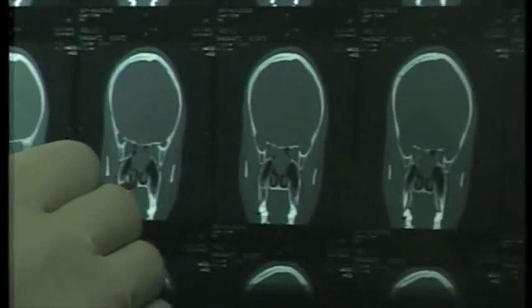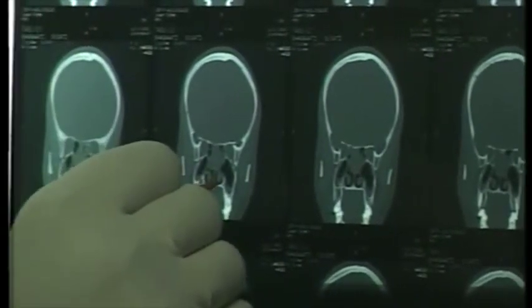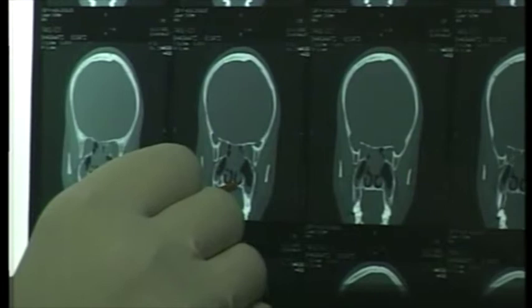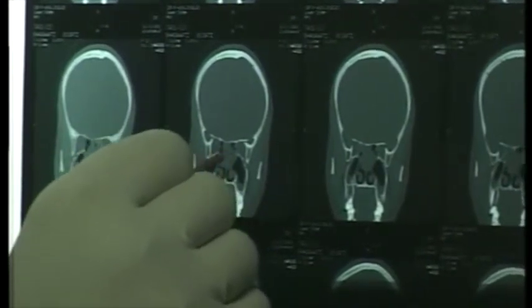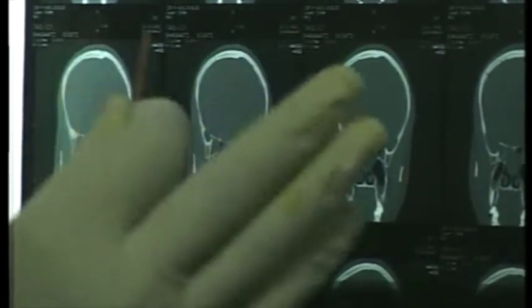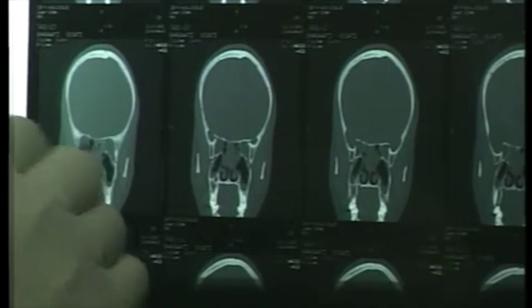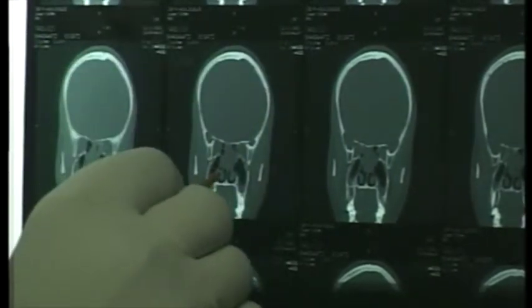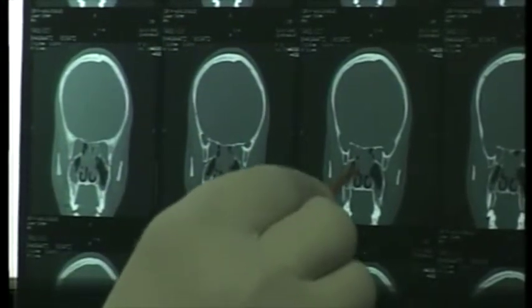The inferior turbinate attaching to the medial wall of the maxilla is very low. You must be having a very wide sinus opening, opened by the disease itself - it looks like somebody has already done a middle meatal antrostomy, and it is widely open.